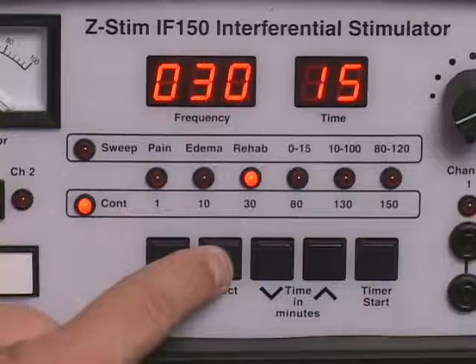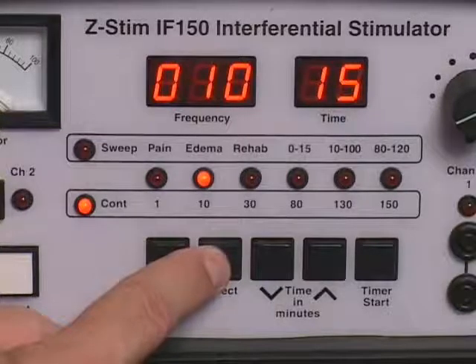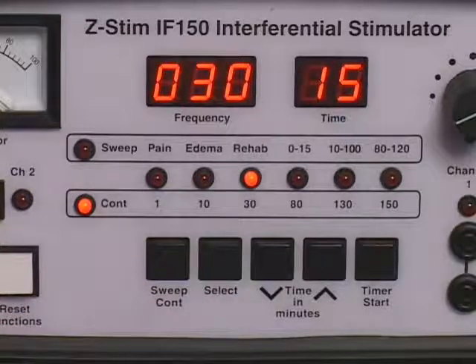Press the select control to select the desired constant beat frequency or sweep beat frequency range. The selected beat frequency indicator light will illuminate and the frequency display will indicate the selection. The constant beat frequency or the sweep beat frequency range can be changed any time during treatment. However, to avoid possible patient discomfort, reduce the intensity controls to the zero reset position, enabling the audible clicks before changing the constant beat frequency or sweep beat frequency range.